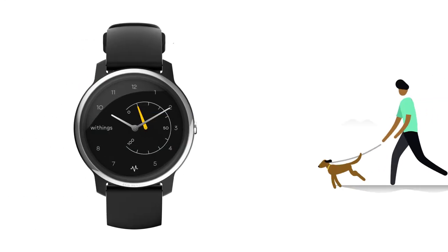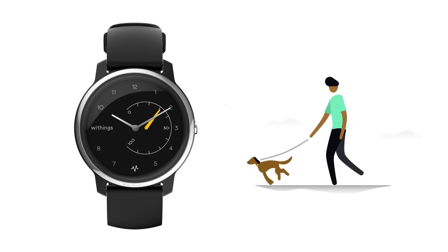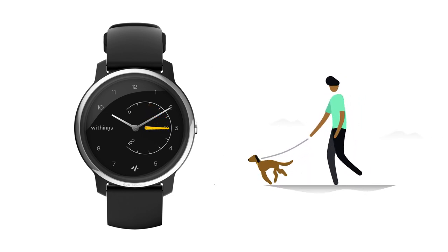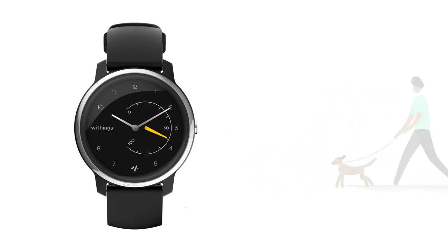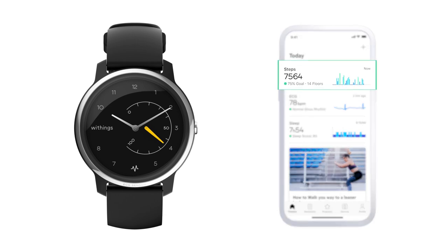During the day, see how close you are to your step goal by simply glancing at the sub-dial. In the HealthMate app, a summary of your daily activity appears after a sync.